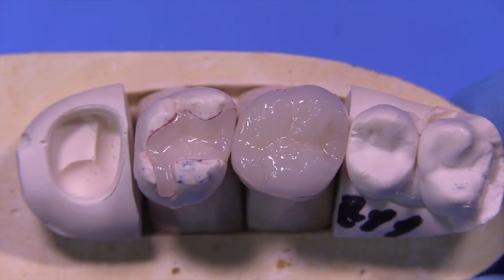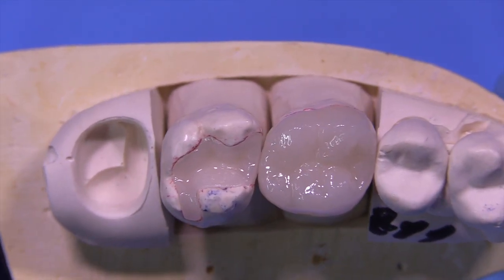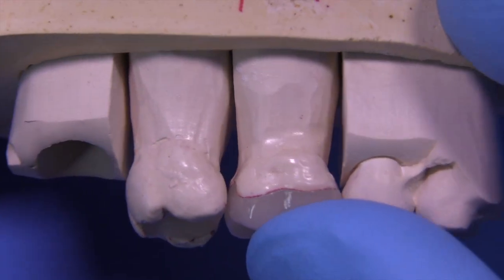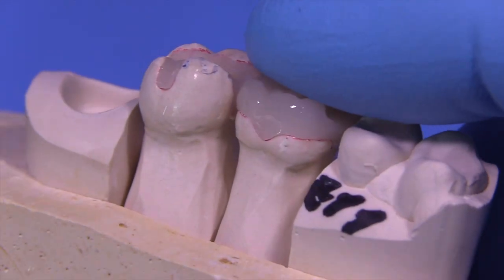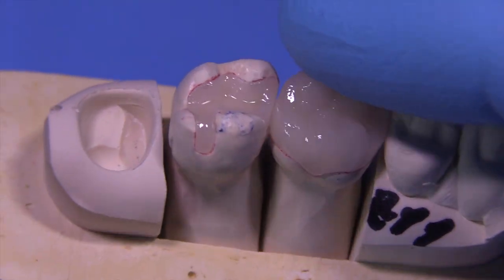The case is back from the lab, and these are pressed ceramic restorations — these are emax. These restorations were made from the lost wax process, where they were waxed up, carved, fitted to the dies, and then invested and pressed. They could have been milled or done from virtual models, but in this case we did them more traditionally.